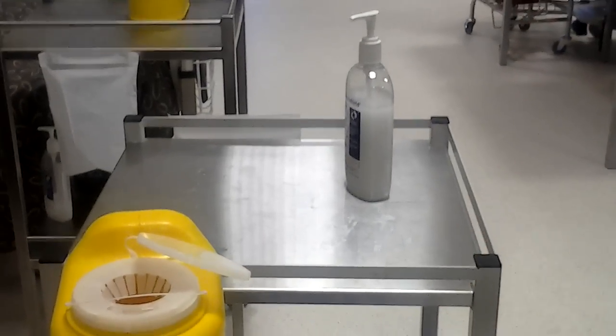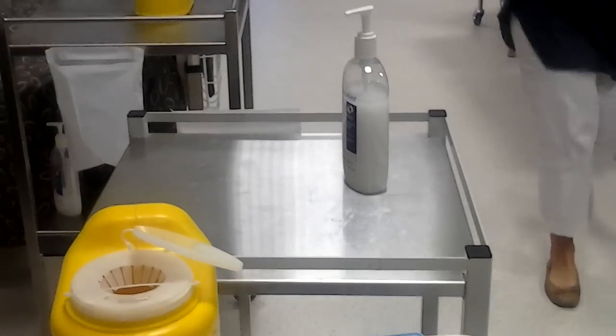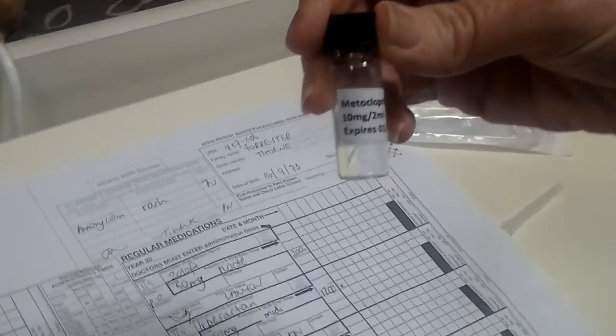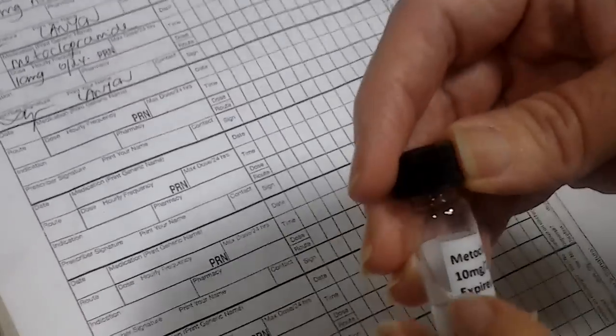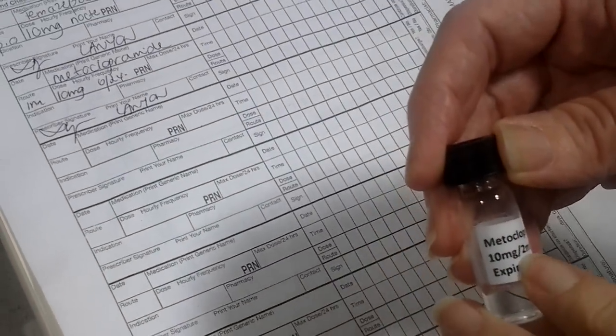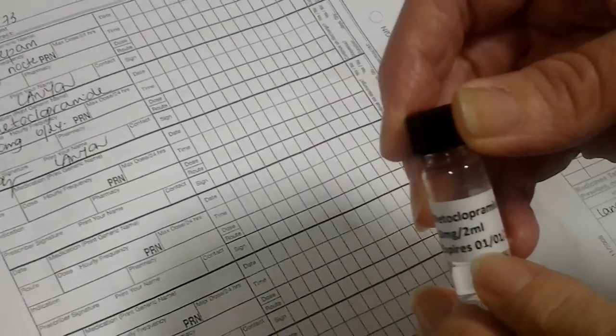Step 8. Check the medication dose and expiry date with the registered nurse against the drug chart. Okay. So we have metoclopramide here. The dosage is 10 milligrams in 2 mils. My dosage is 10 milligrams. The expiry date is the 1st of the 1st, 2015. Okay, and here is my 2 mils. No air bubbles? That's correct. No bubbles.